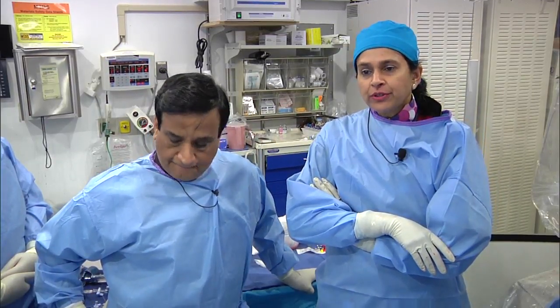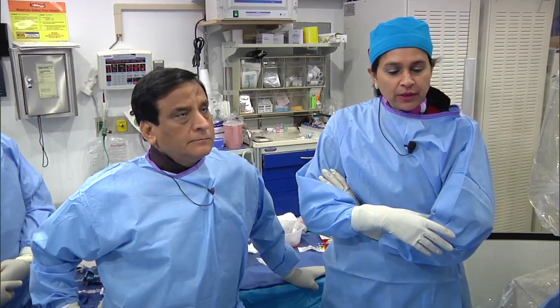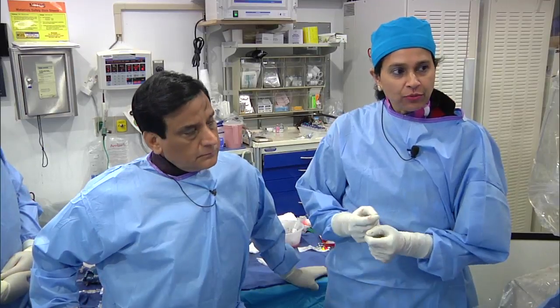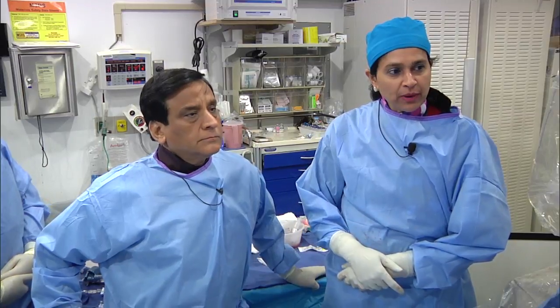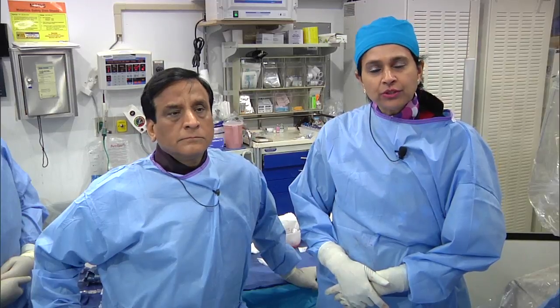The other thing is the wire choice. We used the Runthrough in the OM1, and we used the Fielder in the main vessel. You saw that even recrossing, I was able to recross with the Runthrough, but otherwise you can have your Fielder in the main vessel, take that wire and go to the side branch, and use the side branch wire into the main branch, provided the tip is okay. If the tip has been distorted, it is easier to get into the side branch with a Fielder or Whisper, and just leave your main workhorse wire always in the main branch.